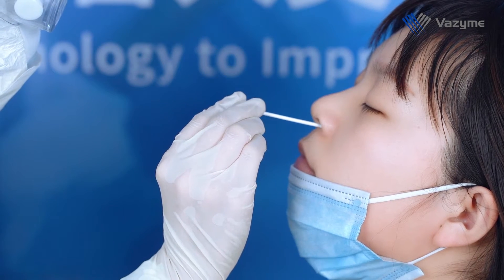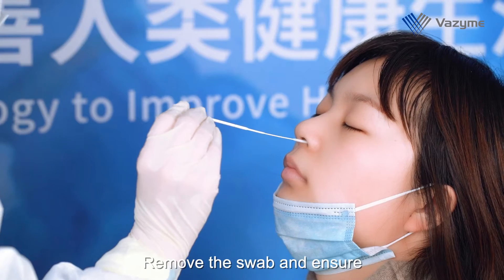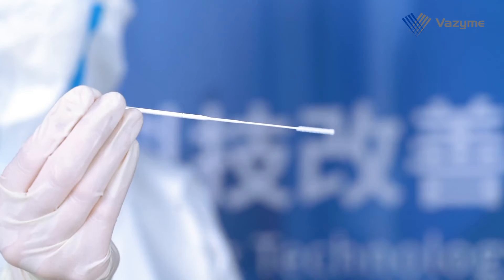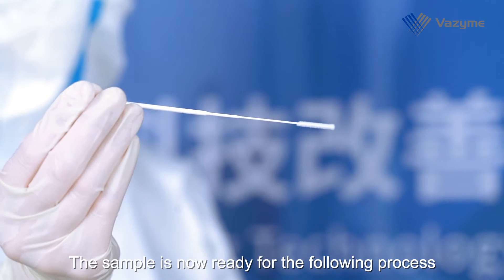Carefully insert the swab into the nostril until the swab reaches the back of the nose. Rotate the swab five times, then remove it and ensure that an adequate sample is collected. The sample is now ready for the following process.